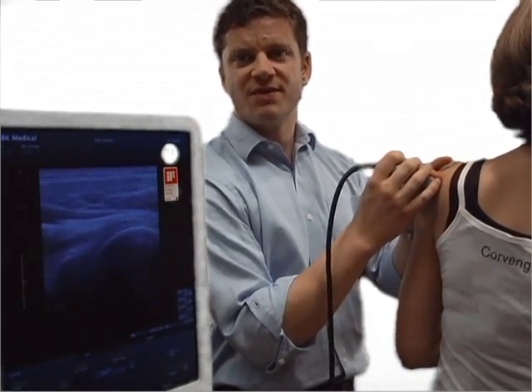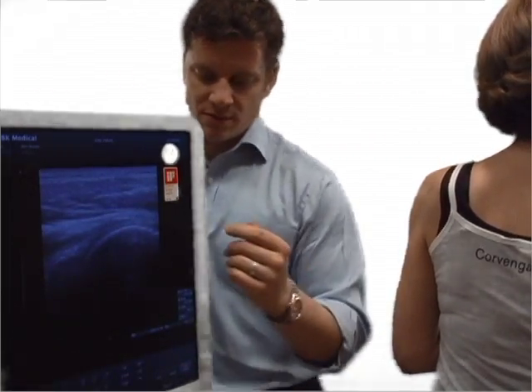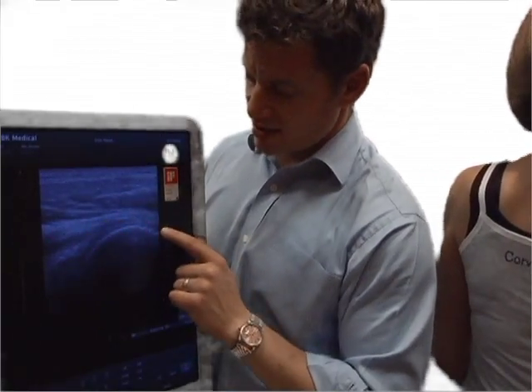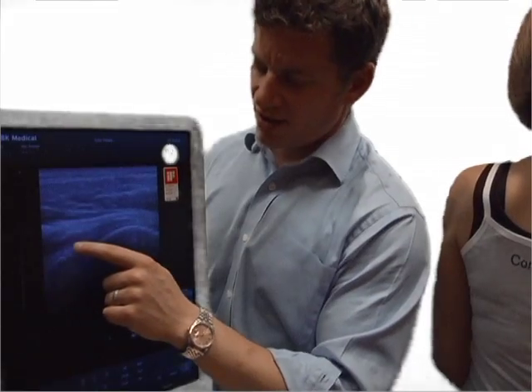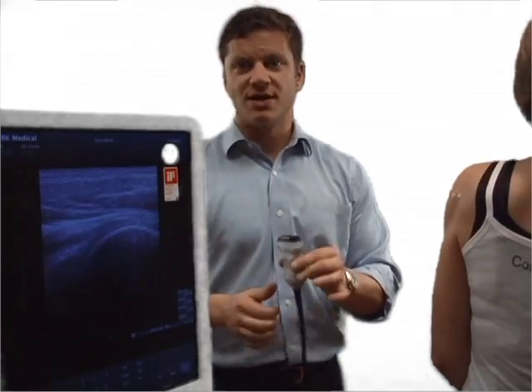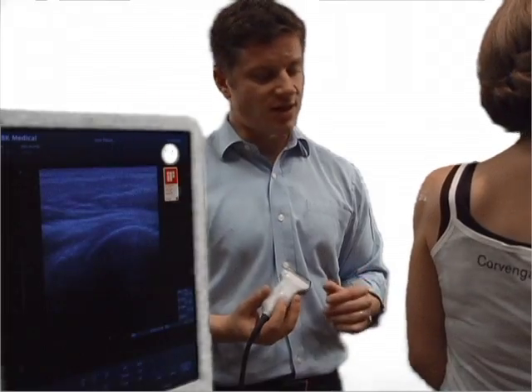Let's review what we're seeing. The infraspinatus is coming off the humeral head, which is right here. The glenoid is right here. And then there's typically a triangular structure that is your labrum. Not every patient — you're going to be able to see the labrum.